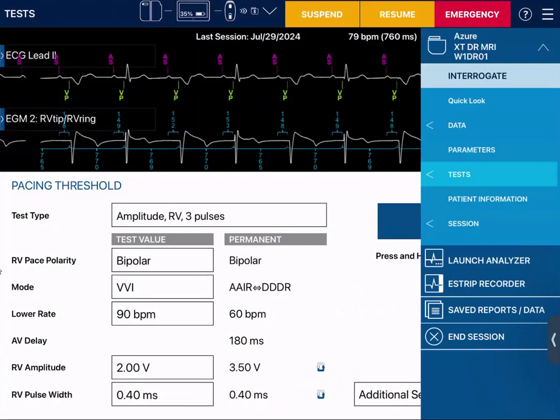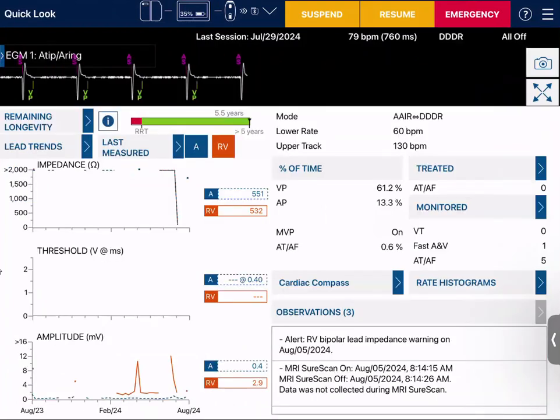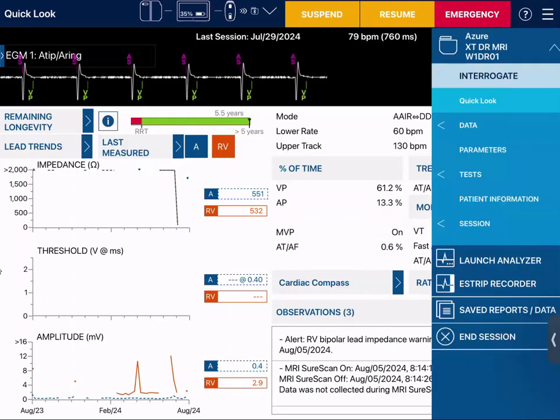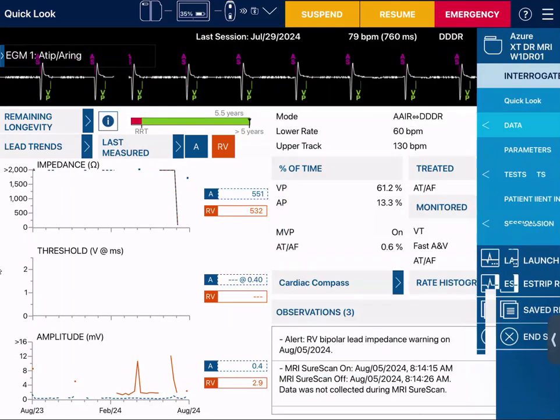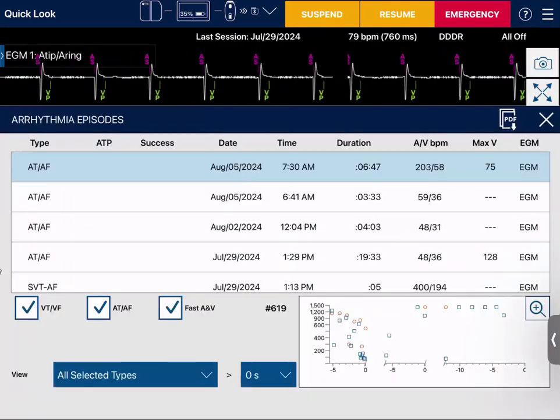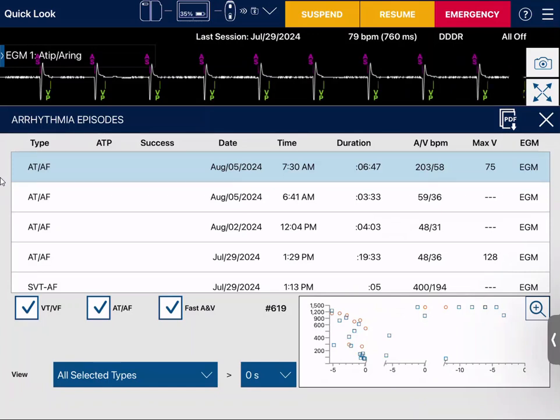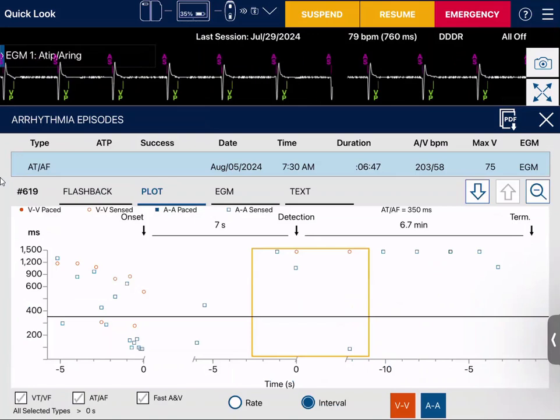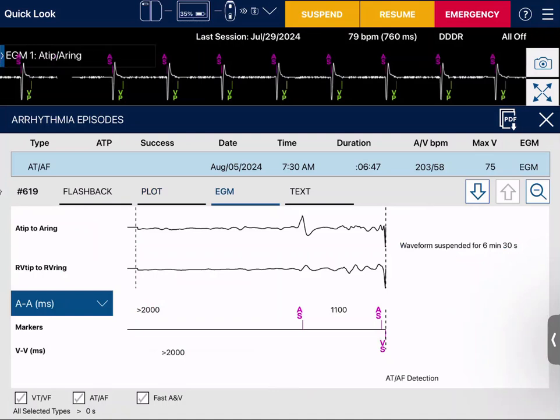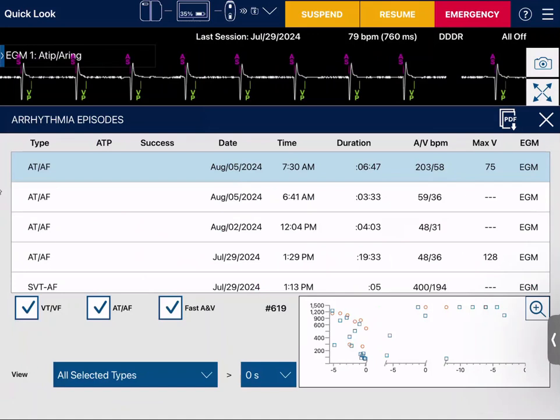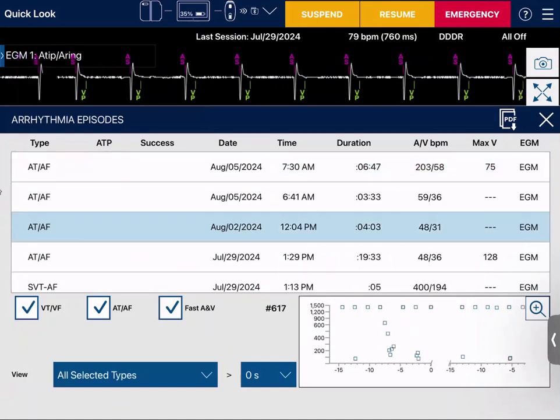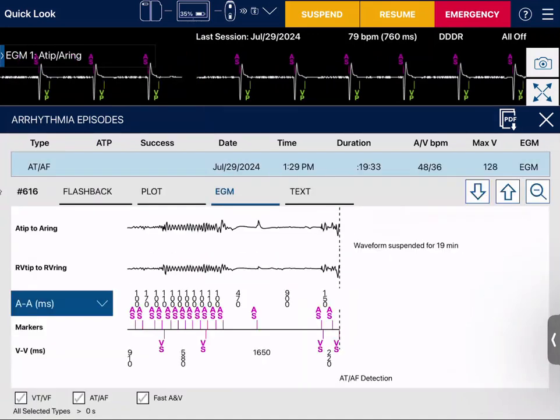I can go back to my quick look screen and review observations. Under clinical diagnostics in the data section, I can click through to see any arrhythmia episodes and verify whether they're true arrhythmia episodes. To make it bigger, click the magnifying glass at the bottom corner to see the plot, the EGM, and the text of each episode. Clicking it again makes it smaller, and you can arrow down through each episode.